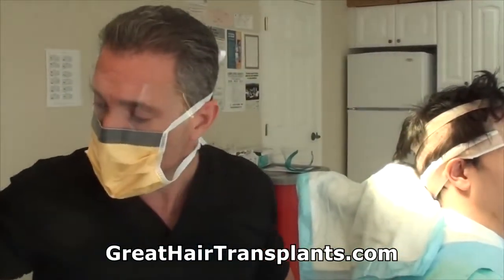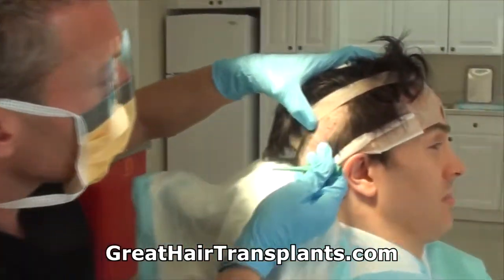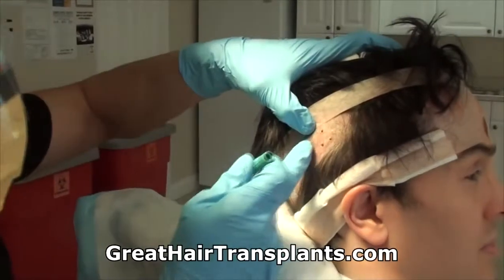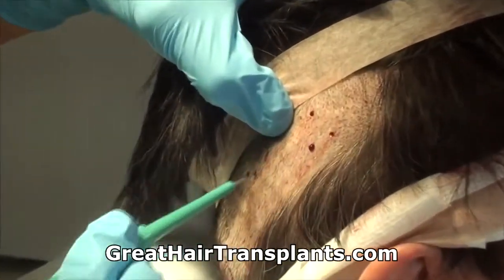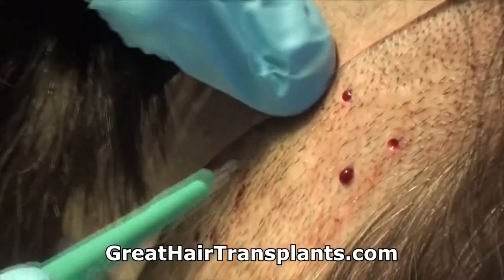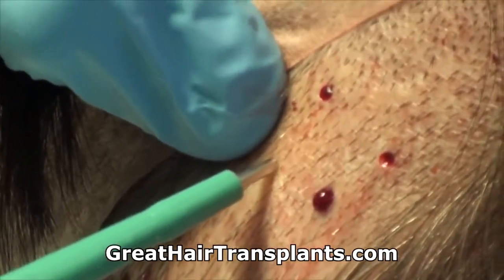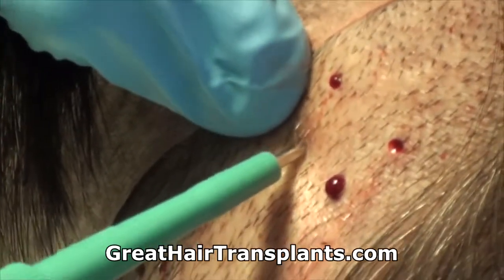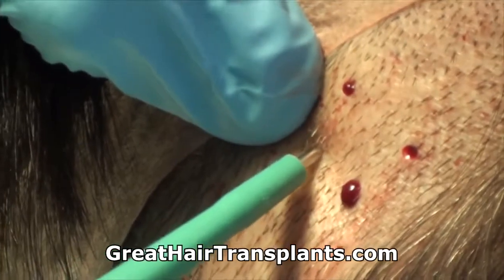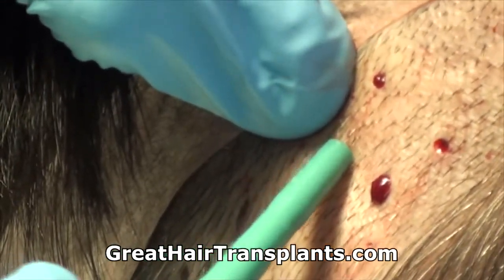I'm going to show you one more example of this just so you can kind of get a feel for this. And I'll go for it again, even though I got a good one. Let's do one more. When there's a scar, okay, from the strip surgery, that changes the directions of the follicles. So now let's go by the scar and see how we do there. So if there's a previous scar. So now we're just going by the scar. Take that little friction out.